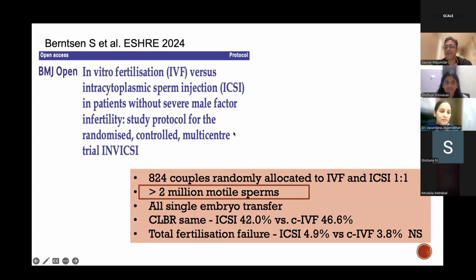With IVF, we want time for the immature eggs to spontaneously mature and then become eligible for fertilization, which doesn't happen in ICSI. In ICSI, unfortunately, once you've denuded the eggs and find them to be immature, they're out of the picture. But with IVF, if you leave them overnight, you see a lot of spontaneous maturation and very high fertilization rates.